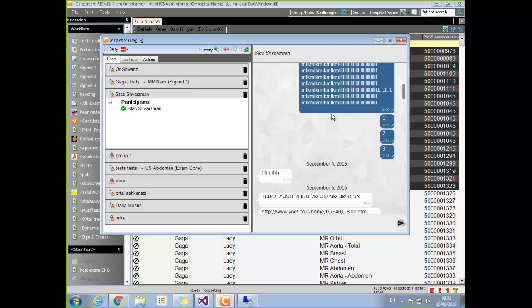So you have one. Okay, so join. It would be nice if it was made URL aware. You know how with a URL you can put a little blue line, so if you click on that it activates. I sent a URL just to check what will happen, but probably it didn't do that automatically. That is something I can see them doing, passing back, oh, check out this information on this URL page. So you copy, paste it in, and it'd be nice if they could click and bring up the page.